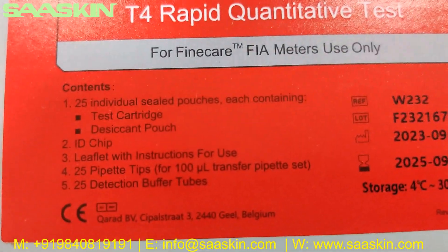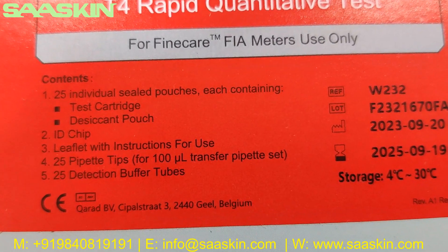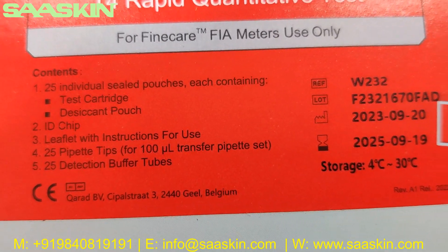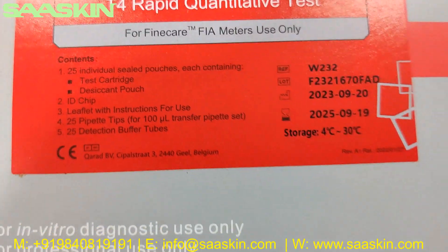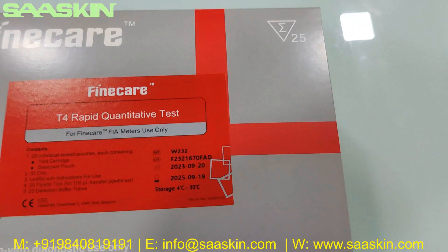In a standard box, you get 25 individual sealed test cartridges, 1 ID chip, 1 leaflet with IFU, 25 pipette tips, and 25 detection buffers. This is a CE-IVD certified product and it is a 25 test kit pack.